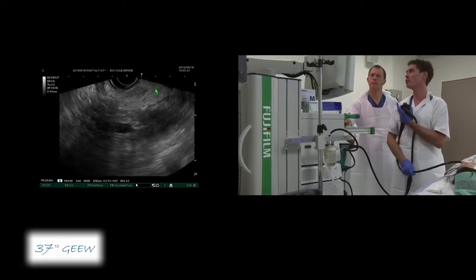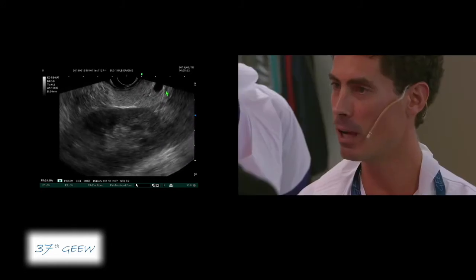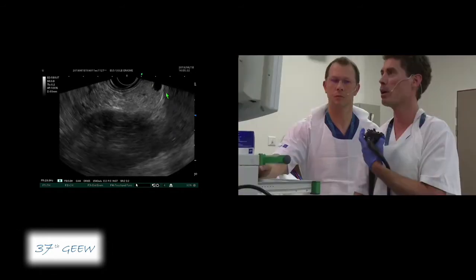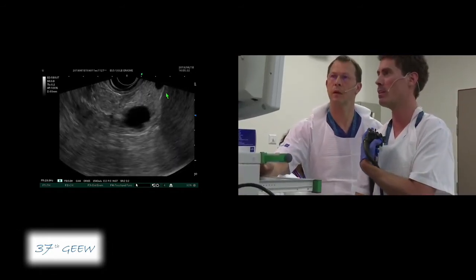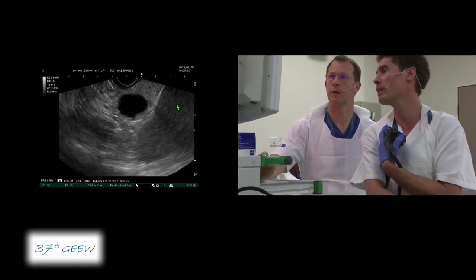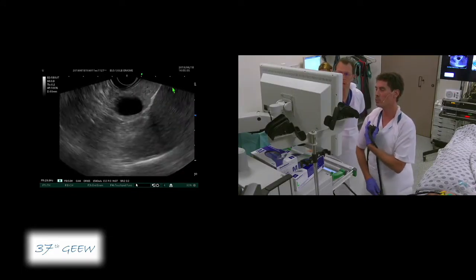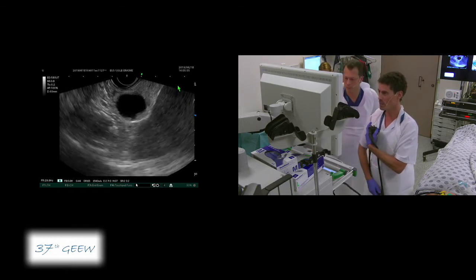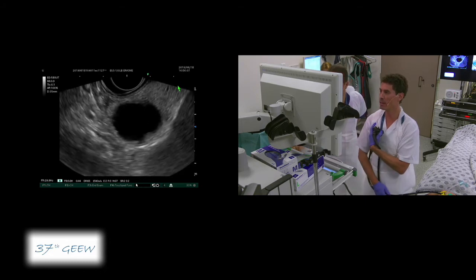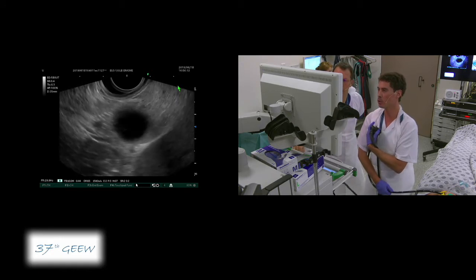So I now have to withdraw the scope to keep it at the center. And you see, as I am turning my shoulders, turning my hand, torquing the scope, I try to keep it at 6. And now we arrive and we see the lesion we need to find. And you see where the arrow is, it's the spleen. So this lesion is really 2 centimeters, and it has homogeneous anechoic liquid at the center. First, for sure, you have to measure it.